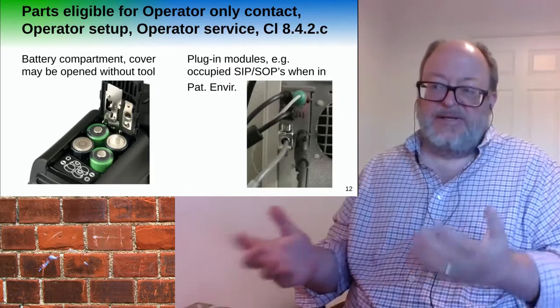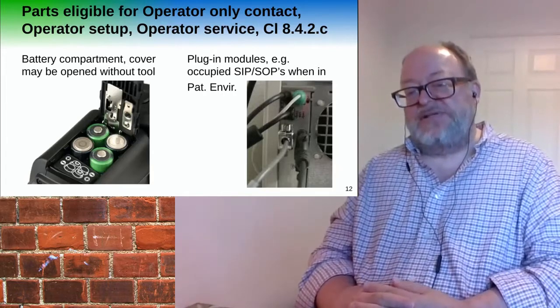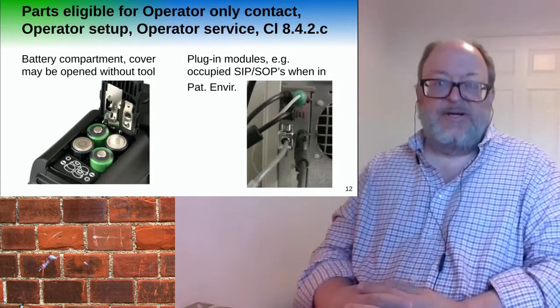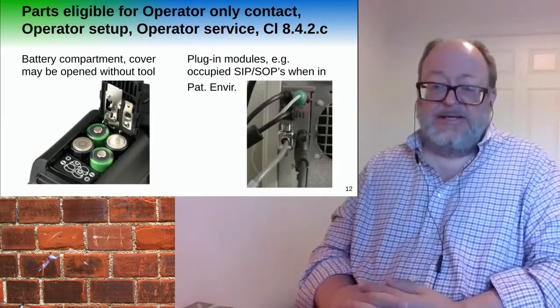Similarly with data connectors, signal input parts, signal output parts, when they're in place, there's no live parts. The pins are low voltage, but when they're being unplugged or set up, we may have access to this low voltage for operators. As long as there's no patient, it's fine.